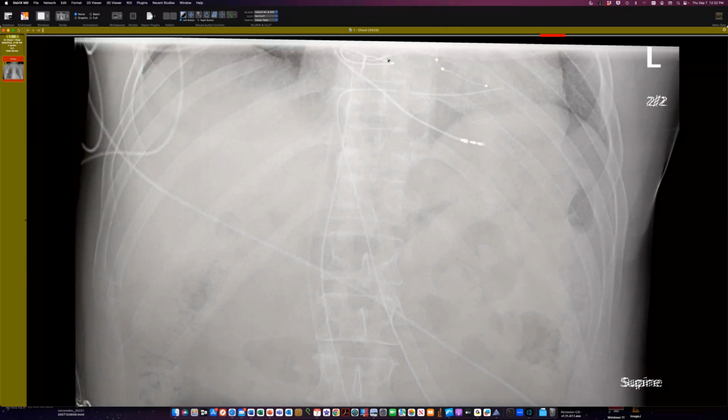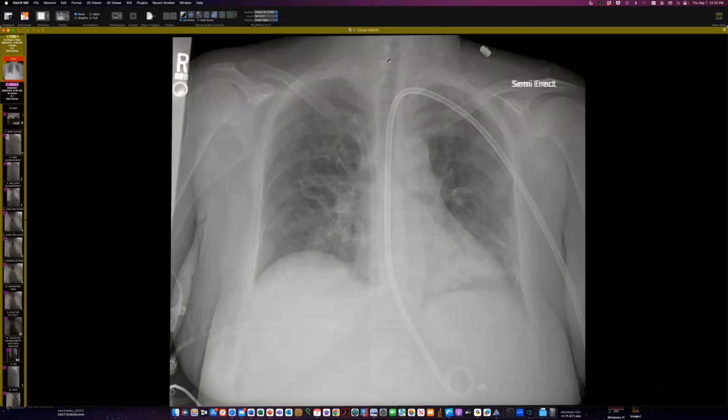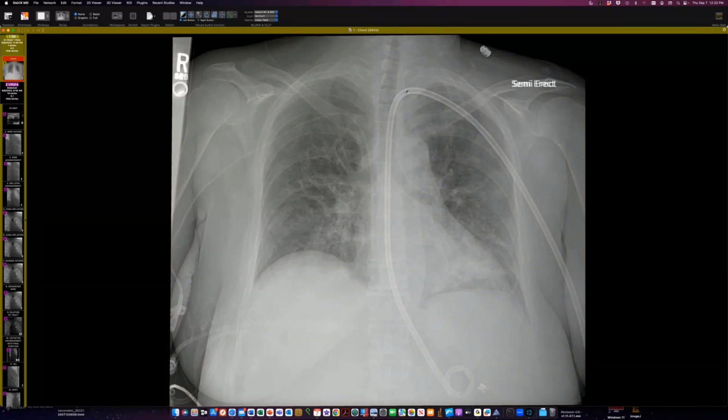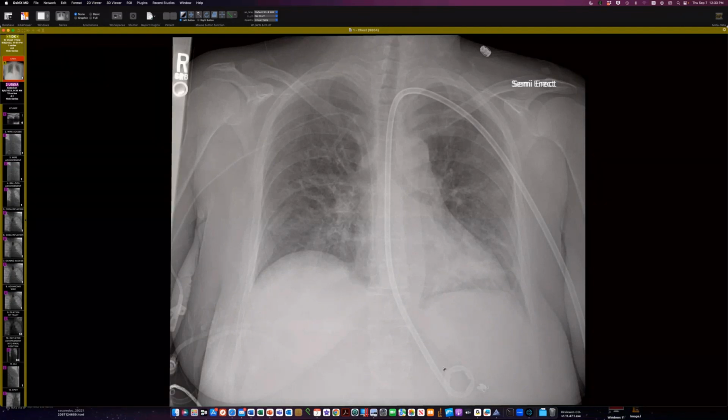That was unintended, so let's see if we can go on. And then here's an unusual placement of an enteric tube. This one seems to go somewhere over the clavicles in the lower neck and then go down. So this is an unusual tube placement. I don't see it coming down from the nose or the mouth. So it turns out there was a lot of work to do this. This was not done casually. So let me see if I can show you the history of this.